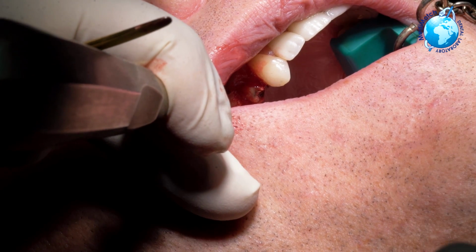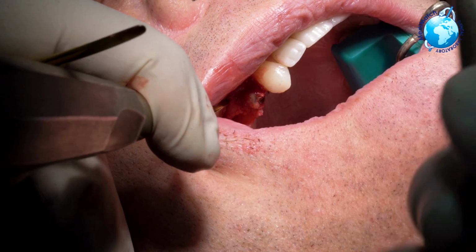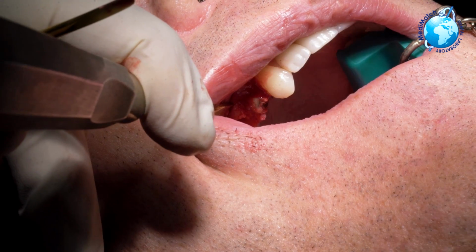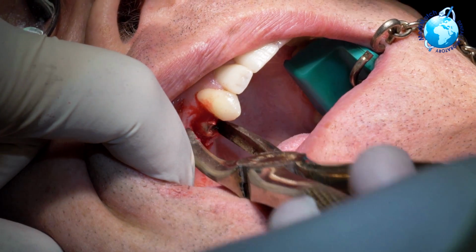Root forceps. Awesome. Thank you very much. Just a little wiggle. Out it comes by the other teeth. So that's the first root removed, Alan. Awesome. And we're just going to take the second one now. Let's get this fella.